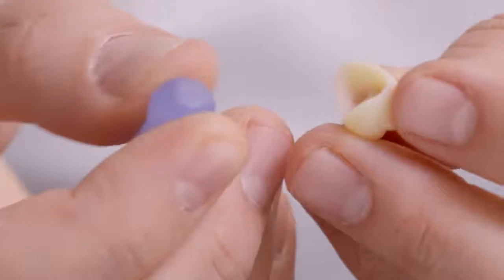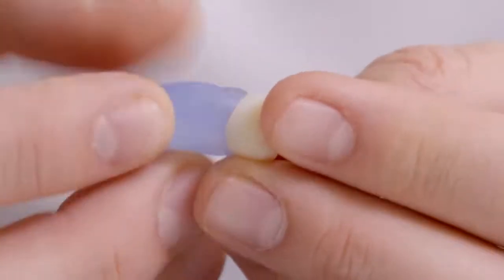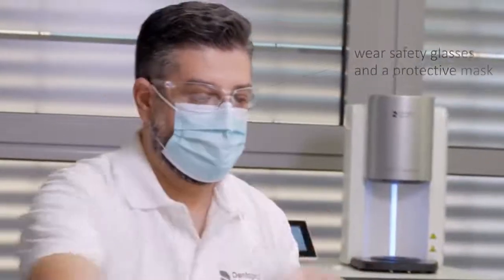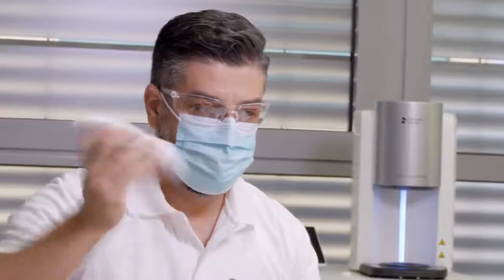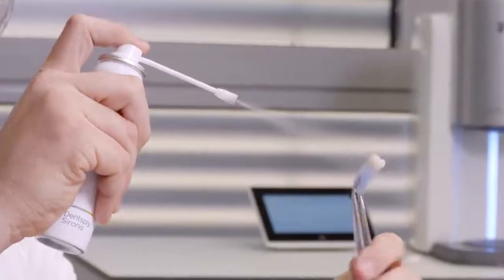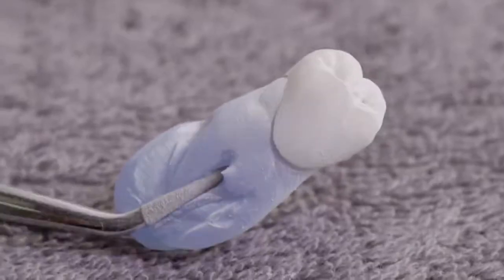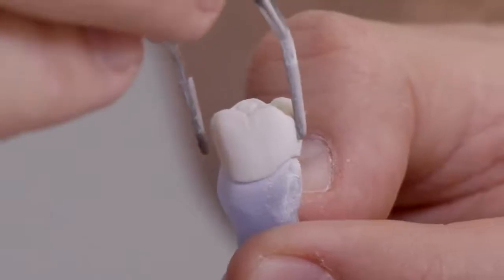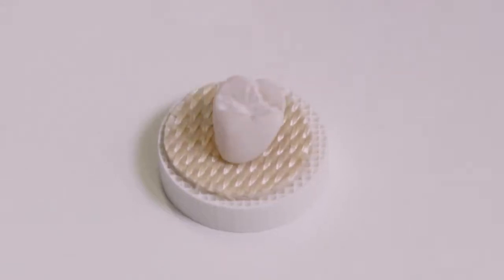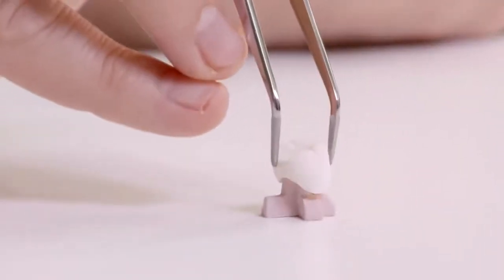First, the inner contour of the crown is protected with a moldable silicone. For the best distribution and a homogenous spray result, the spray bottle should be shaken for at least 20 seconds. Then the crown should be sprayed evenly from a distance of 10 to 15 centimeters. The sprayed crown is now lifted off with tweezers, and either a firing fleece can be used to place the crown on the firing tray, or the object can be placed on an investment pin directly on the firing base of the furnace.